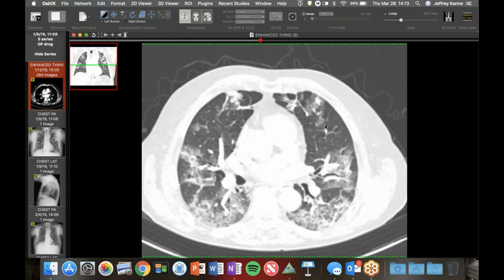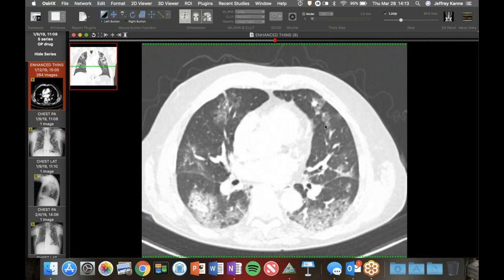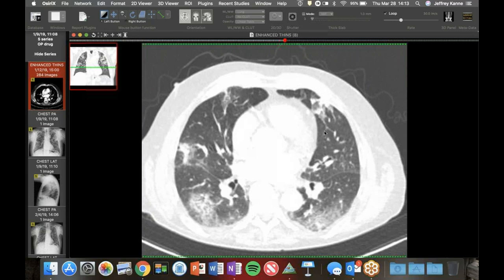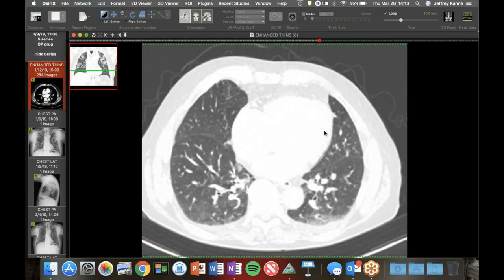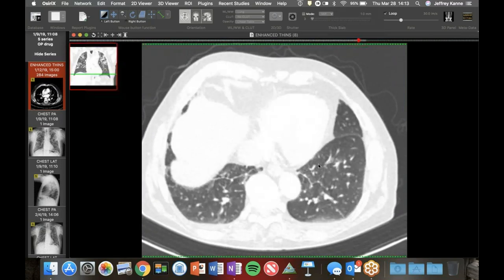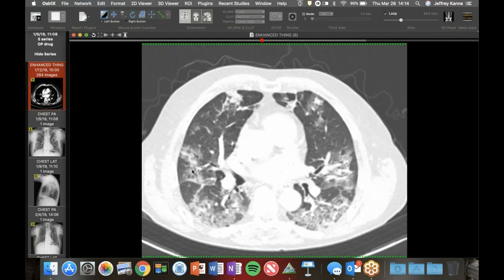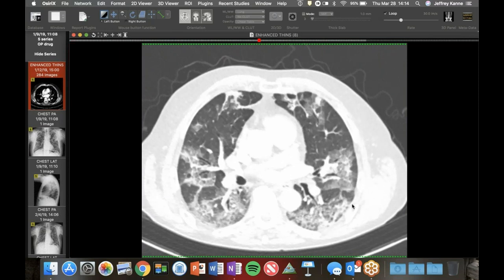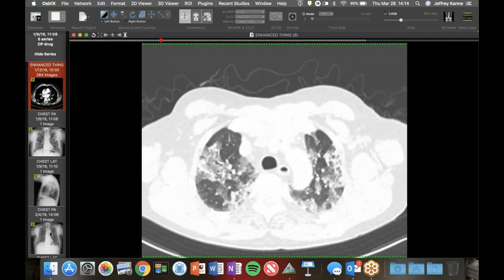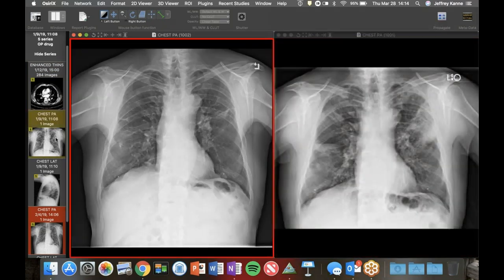Typically with edema, hemorrhage, and infections, you get fuzzier margins, whereas organizing pneumonia tends to be more confined by natural anatomy. You've got some stuff around the airways and vessels, little patchy areas of ground glass. There's a nice sort of arcading, sparing some lobules - discrete lobular sparing. So this would be more extensive organizing pneumonia. The drug was stopped, steroids were given, and you can see dramatic improvement in just about four weeks.